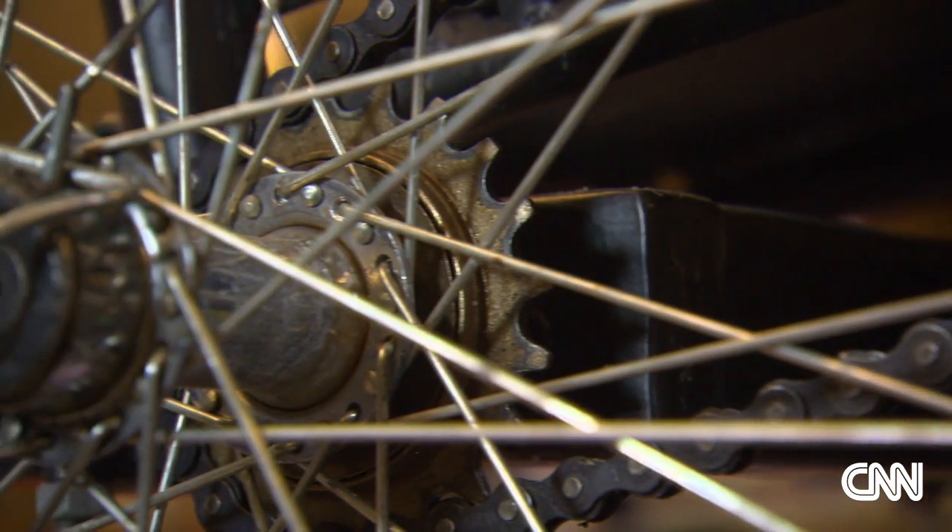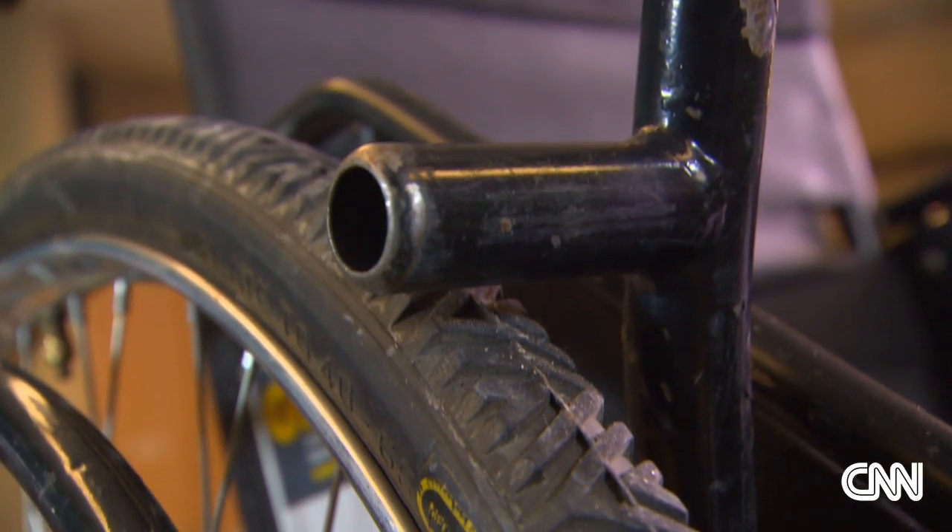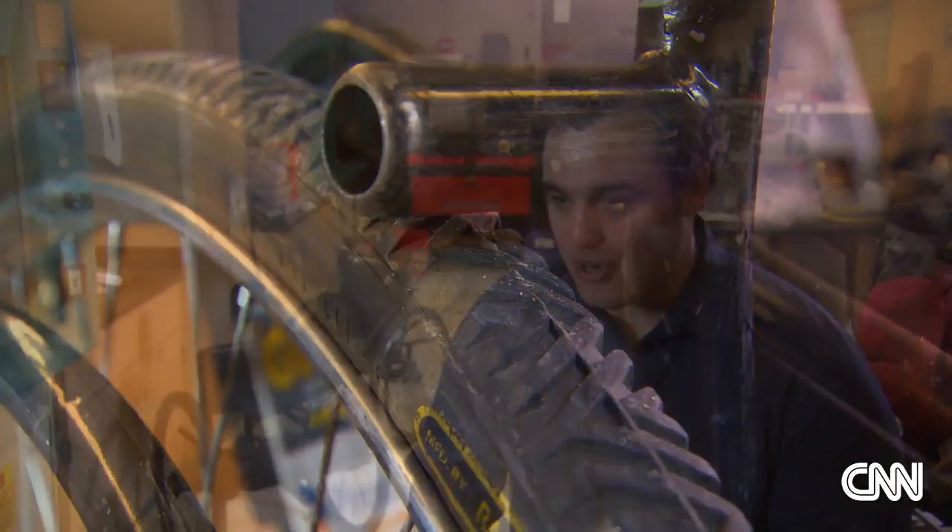Spokes, sprockets, hollow tubes of steel — they are the base elements of design ingenuity. We had to make an ultra-low-cost, super-robust, very simple mobility aid that didn't exist before. We essentially had to reinvent the wheelchair.